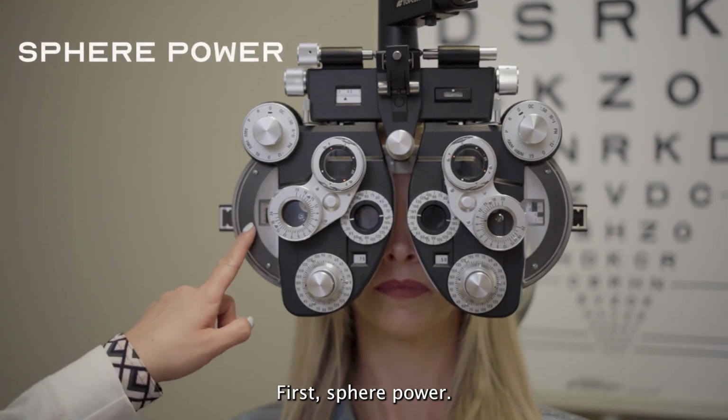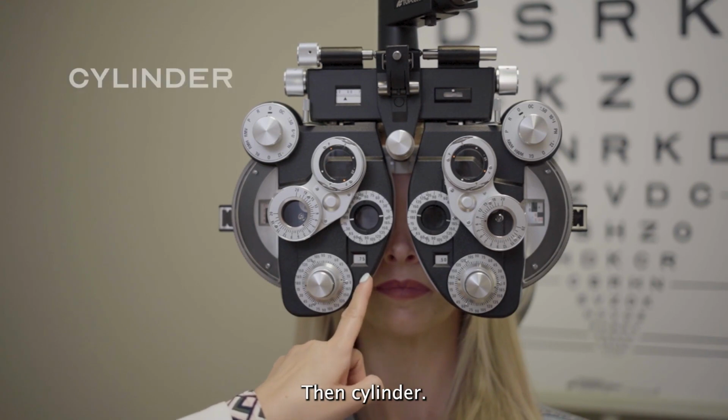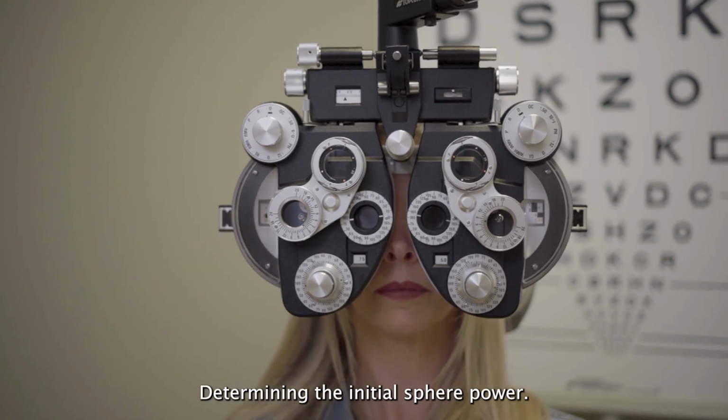This is typically the order of refraction. First, sphere power. Second, axis, then cylinder, and finally return to and recheck the sphere power. Determining the initial sphere power.